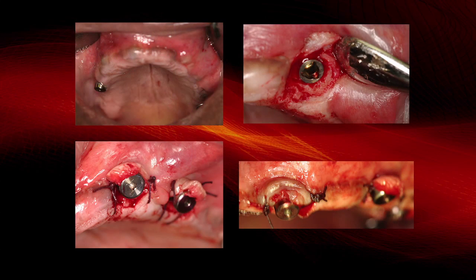So here we see either 5 or 6 implants were placed, I believe 6, for a bruxer hybrid zirconia prosthesis, and this is at the uncovering stage. So we see that the implants' trajectory came to the facial, and we don't want to use a tissue punch because then the buccal and the labial margins are going to be in unsupported, non-keratinized tissue.